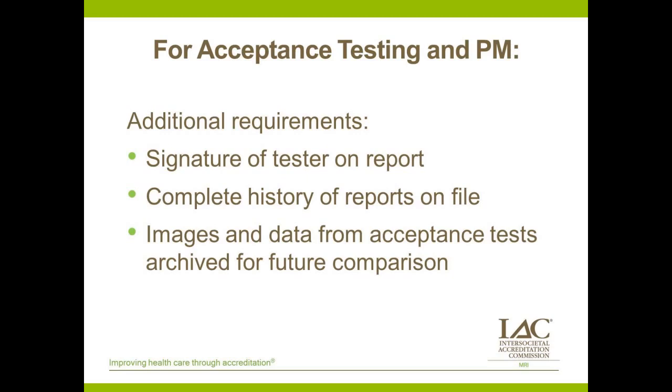It may not always be preferable to keep all that stuff on the scanner, but if there's a way to archive all of that in a way that it's accessible in case you want to do a comparison, because in the future, when you repeat these tests during preventative maintenance especially, it's helpful to be able to go back and compare and say, well, what was the scanner doing when it was brand new, right? We notice something that looks a little strange. A lot of time can pass between these tests being done, anywhere from 3 months to a year at a stretch, going from one instance to the next instance.